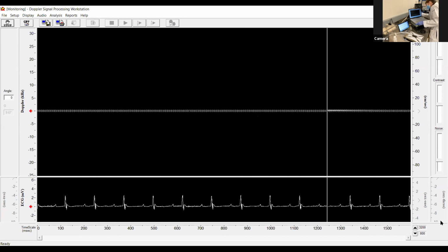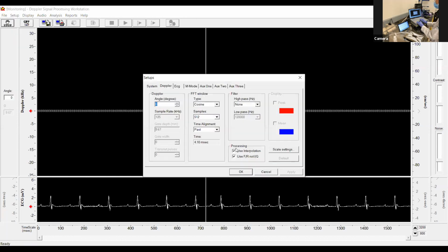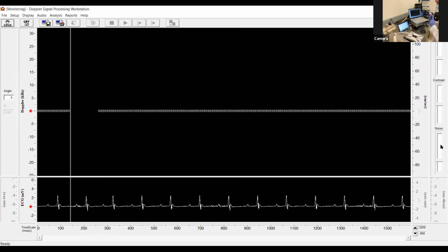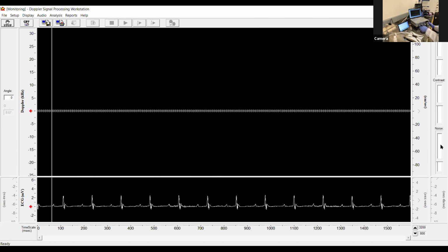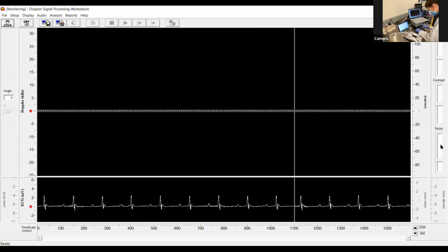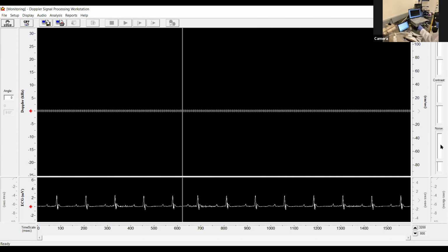So it's just unplugging and replugging one cord at the back and then a small change within the software so that it's not looking to display the signals on top and bottom of each other. And then we're back to our normal viewing angle. Perfect, got it.